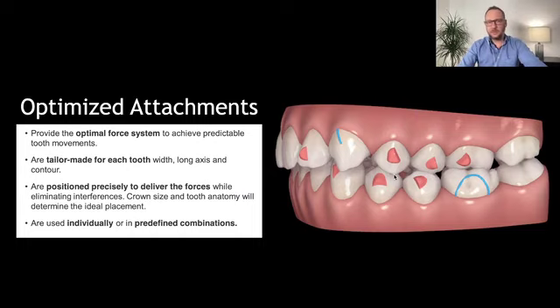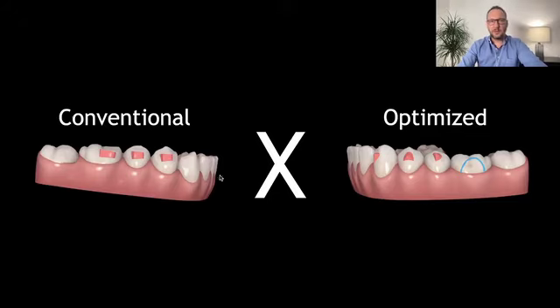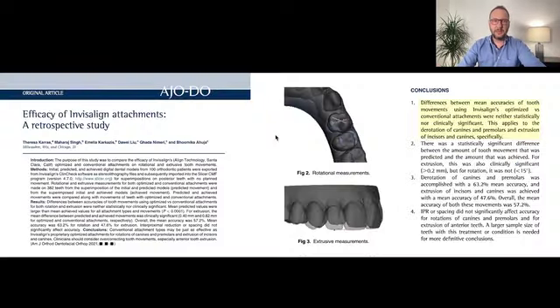So they don't explain much about it, but I can understand when it's better to keep and when I prefer changing for you. So this is a decision that you can make. And again, I have a lot of colleagues, they never change optimized attachments, others they change all of them. I try to be in the middle. Sometimes I like to keep them, sometimes I like to remove them, okay?